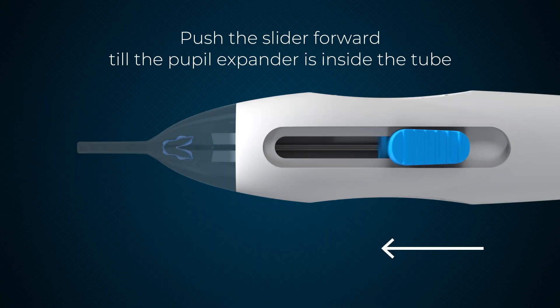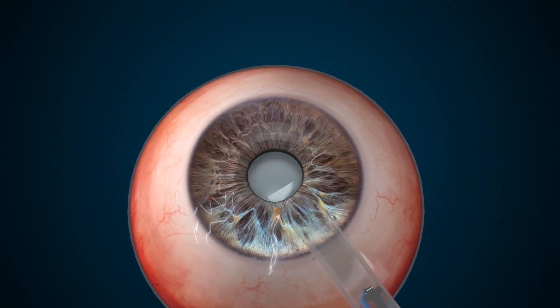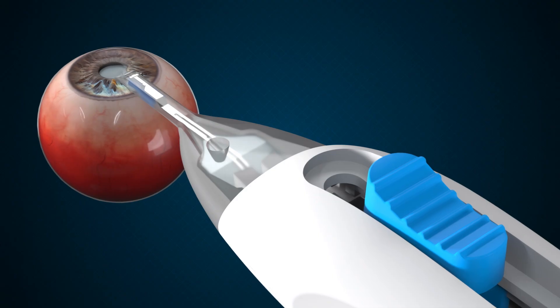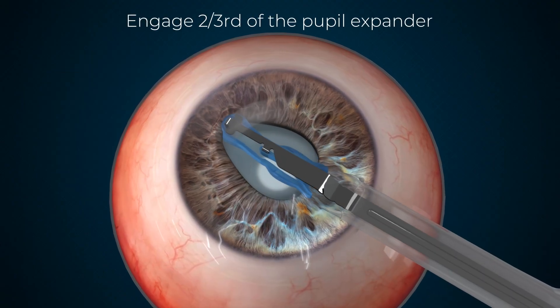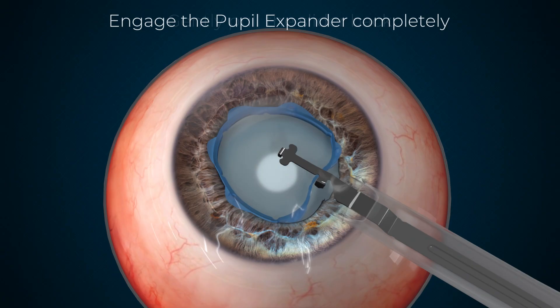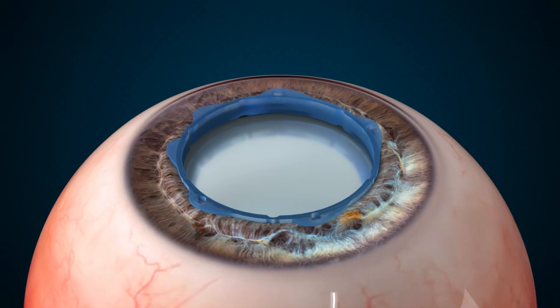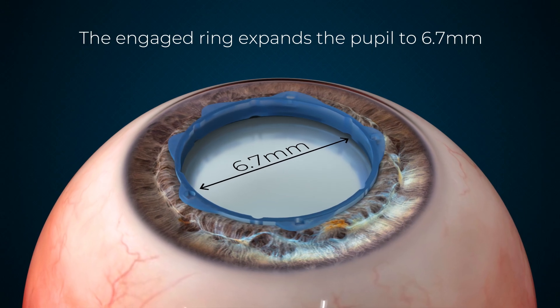Push the slider till the pupil expander enters the tube. Insert the injector tube into the eye and move it to the center of the pupil. Push the slider further and engage the pupil expander two-thirds of the way. Gently pull back the slider, engaging the proximal flaps with the iris margin. The engaged ring expands the pupil to 6.7 mm.